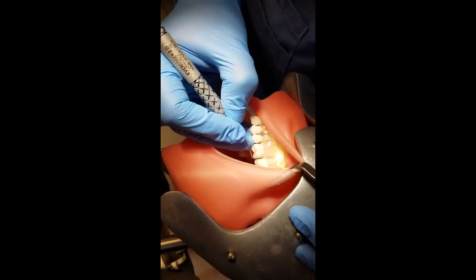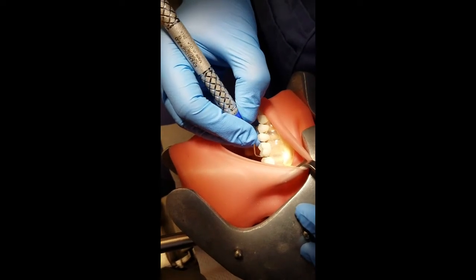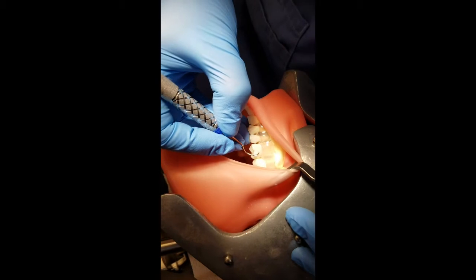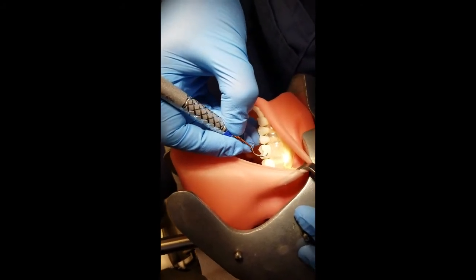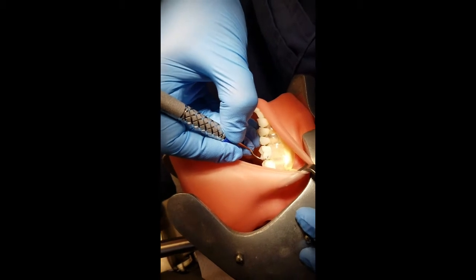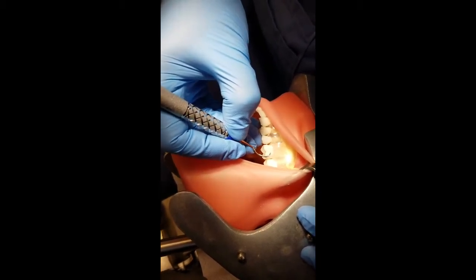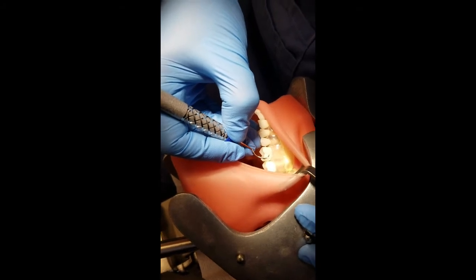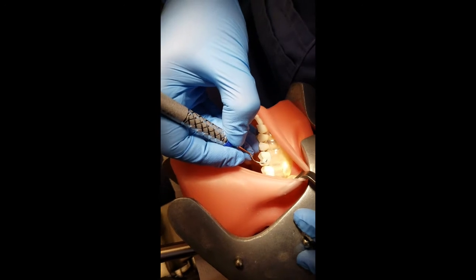When you've reached the contact area, back your tip out and adjust it toward the tooth so that it's now facing in the mesial direction on the tooth. Start at 1 stroke before the distal line angle in the middle of the tooth to begin your oblique stroke. Still using the same distal rock to explore and mesial rock to scale, the stroke should be kept small so you don't fall off the face of the scaler.